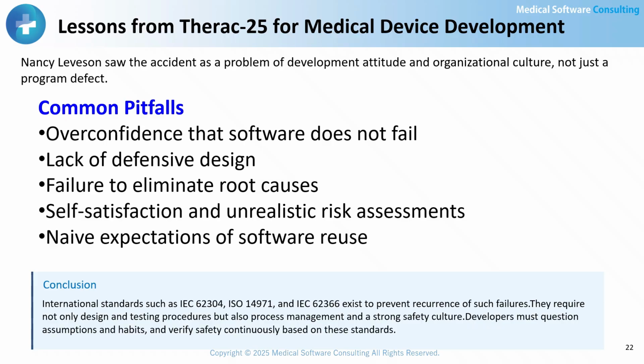Developers must go beyond regulatory compliance and design techniques. They must constantly question their own assumptions and organizational habits and continuously verify safety. Only by improving not just technology but also organizational culture and decision-making can truly safe medical devices be achieved.